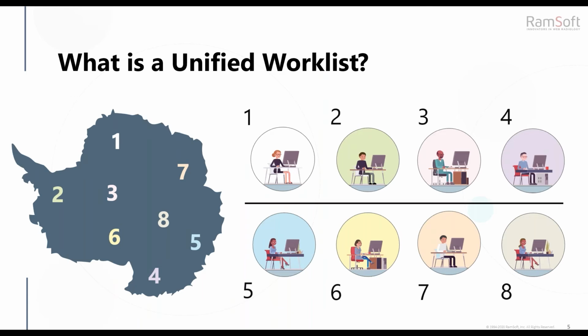So what is a unified worklist? From a simplistic point of view, a unified worklist takes patient study data from multiple sources and presents it in a singular worklist with the goal of increasing efficiency. So let's say you're an imaging center practice with 8 locations. With Ramsoft, you can combine data from all 8 locations into a single unified worklist based upon role, study statuses, study types, locations, or whatever workflow best fits your practice needs.